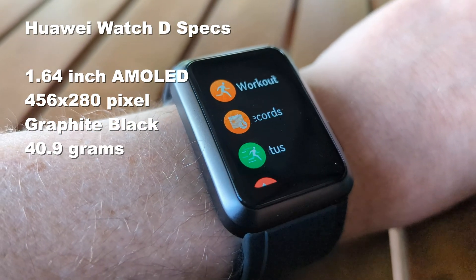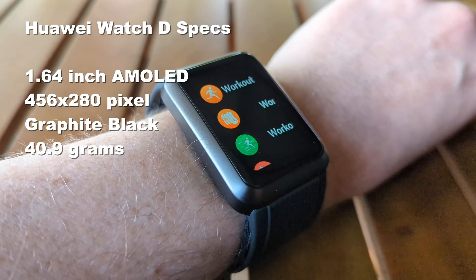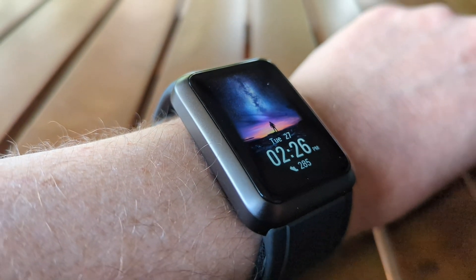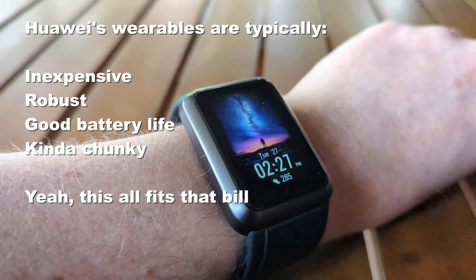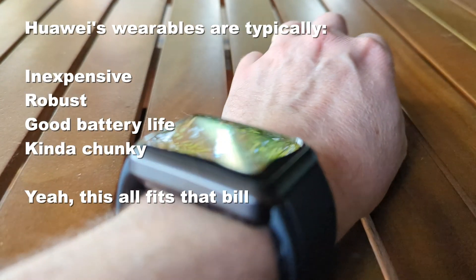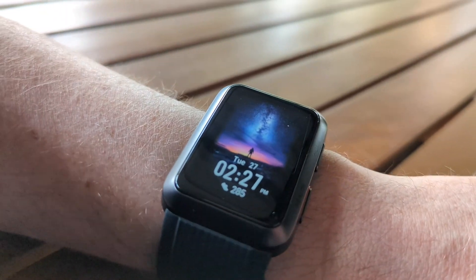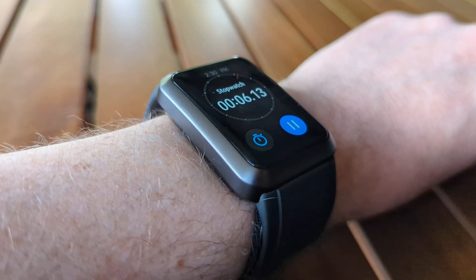Huawei here in Australia is predominantly now in the wearables and audio space because by and large they're out of the phone space because of that whole Google thing. They've produced some interesting devices in recent years in wearables, typically with really good battery life, but somewhat hampered by that Google block if you want to pair them with an Android phone. It's that weird situation where Huawei itself produces Android phones, but its wearables are actually easier to pair to iPhones. And all of that is pretty much true of the Huawei Watch D, which acts a bit like a supersized version of the Watch Fit 2.